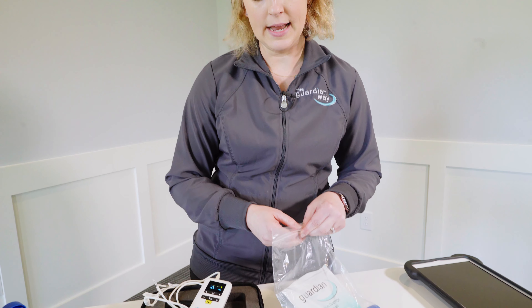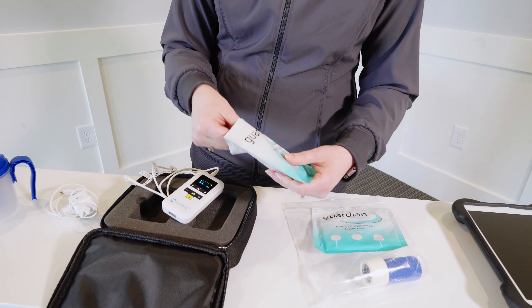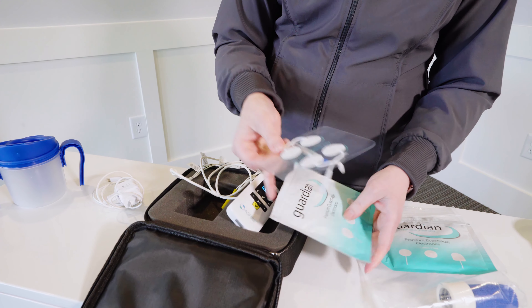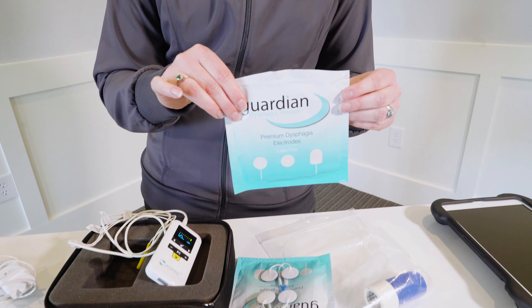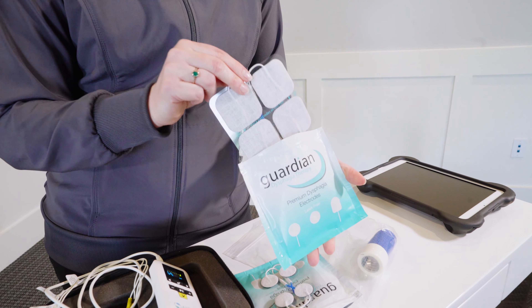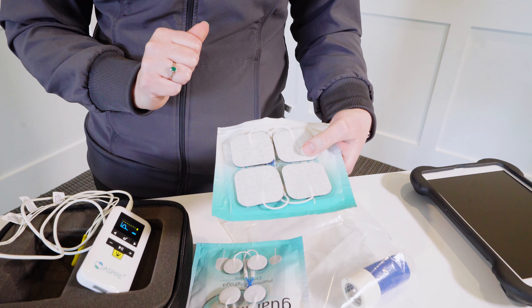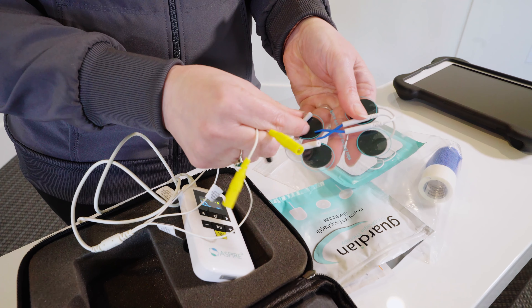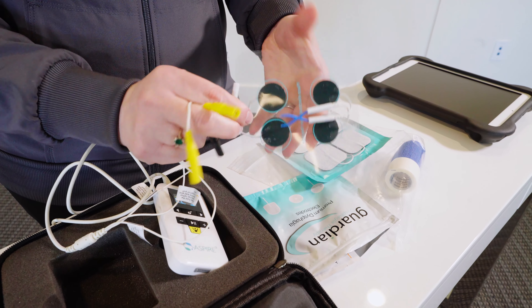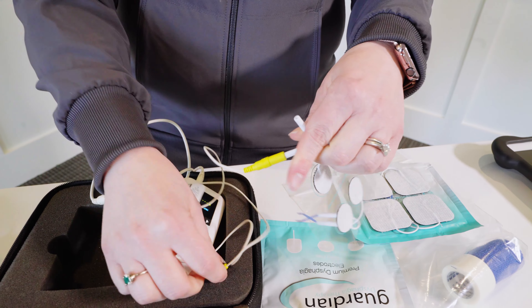When placing electrodes, you have two different sets included. You'll need your round electrodes to place over the muscles where you want to read the signal, and you also have your package with your reference electrode. You'll notice this is a larger 2x2 and we only need that electrode when we're using surface EMG. Your lead wires are color-coded, so you'll disconnect the electrodes from that little X on the back and gently push until you have a solid connection.